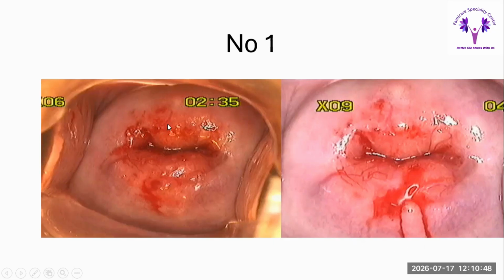So what we can see is that in this patient, the new squamocolumnar junction is clearly visible, and here is one Nabothian follicle which is being highlighted. There are multiple vessels seen here. The ectocervix is dusky. It is clearly dusky here, and if you see here, again it is giving a dusky appearance, and it bleeds on touch because of the marked vessels present. These are not abnormal, these are branching. You can see tree-like branching vessels. So they are absolutely normal, nothing abnormal in this.